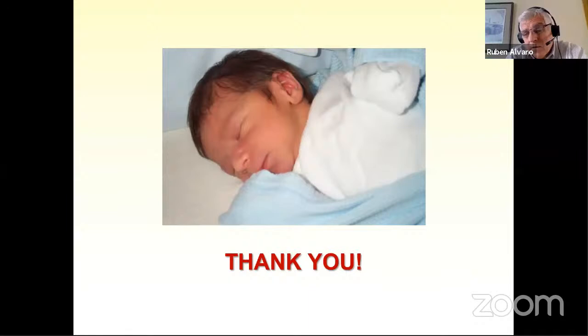If you have a small baby, you can definitely try the VN500, and if you know how to use it, most of the time it would be fine. The differences are very minimal. But again, nobody has done a study to show which one is better. I think the SensorMedics is more of a true oscillator than the VN500. Okay, thank you very much.